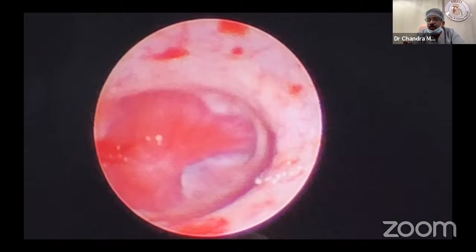use the flexible nephroscope. I am going to use here, no conflicts of interest, Biorad flexible nephroscope 13.5 French. The sheath I have put is 15 French. Water flow logistics will be good. How a 15 French sheath with a 13.5 French nephroscope goes into all calyces, and the inferior calyx we have not seen so far. Upper ureter we have not seen. Upper calyx we have seen. Middle calyx we have not seen. We can see nicely. So next 6 minutes is only extra.